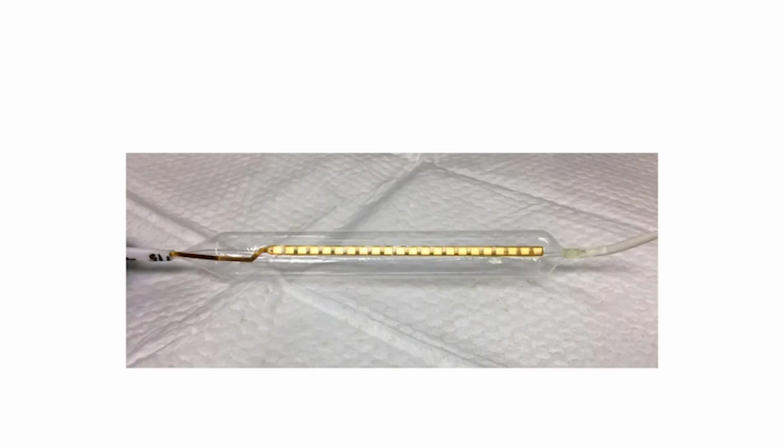Because the quality of the baseline impedance is dependent on good contact with the mucosa, new devices have been developed, such as this balloon catheter with impedance segments attached.